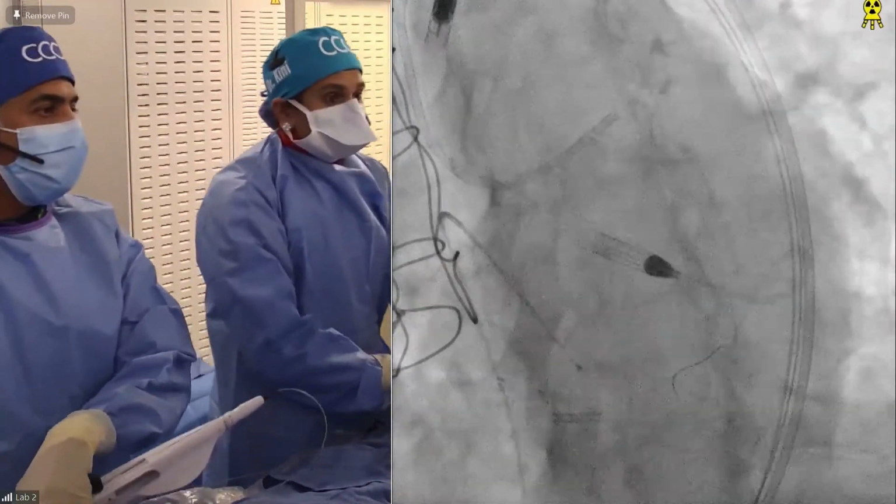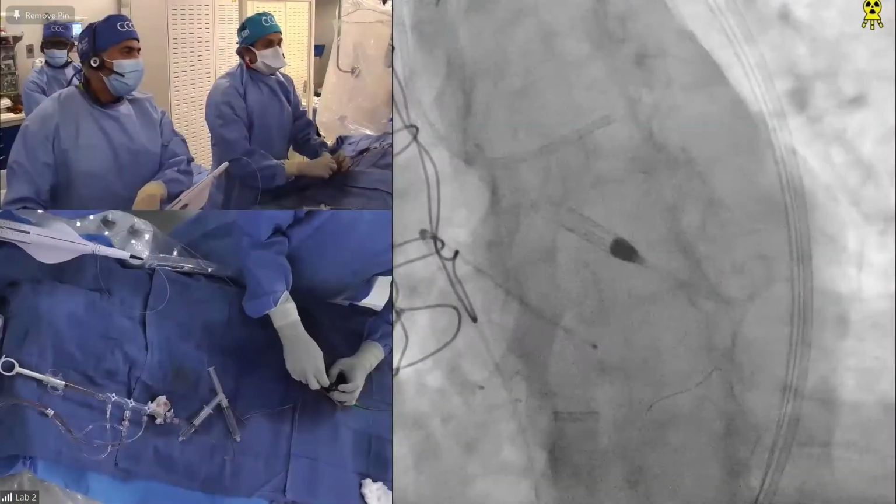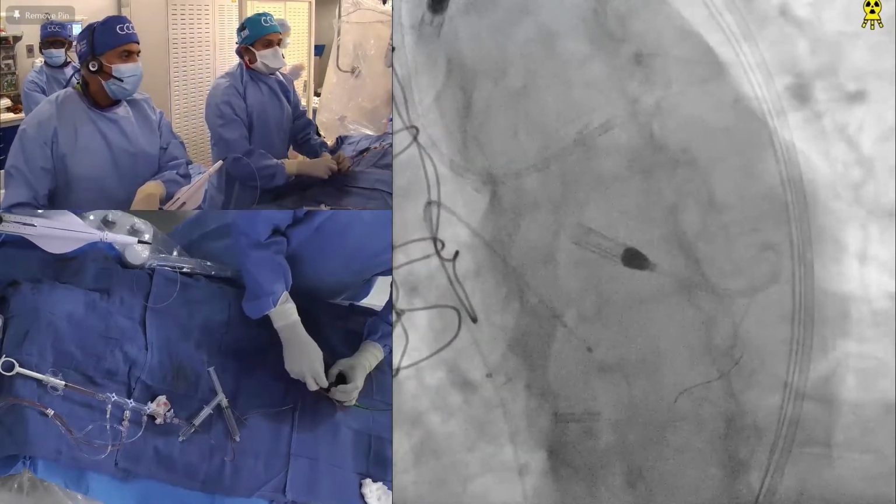So, Dr. O'Neill, what do you think? Going with 1.25 instead of 1.5? Pretty good, huh? 1.25. Slick. Yeah, that's fantastic. We usually talk about 1.5, but I'll go with the smallest burr available.